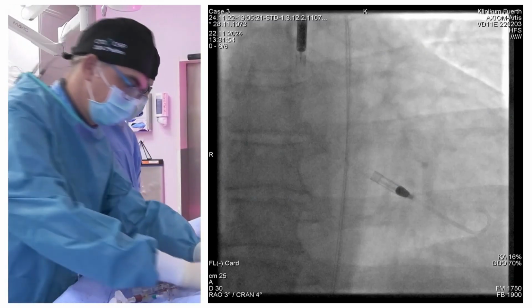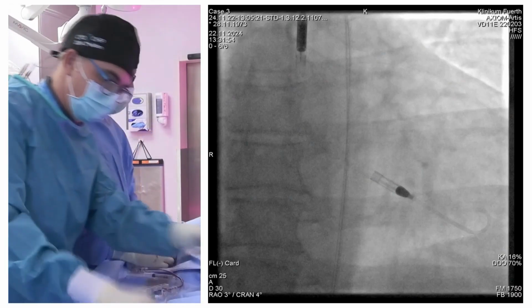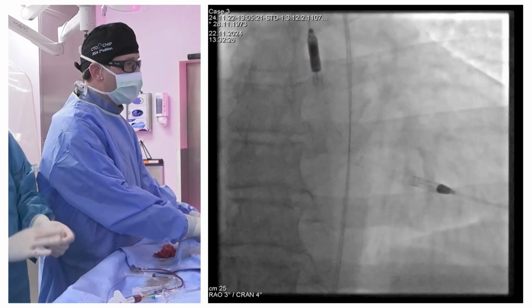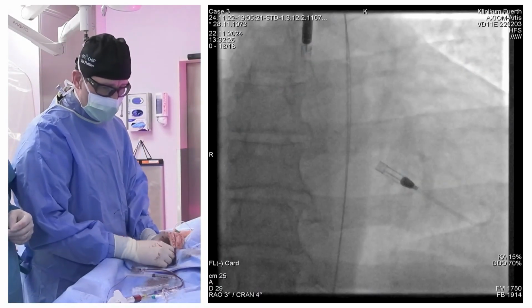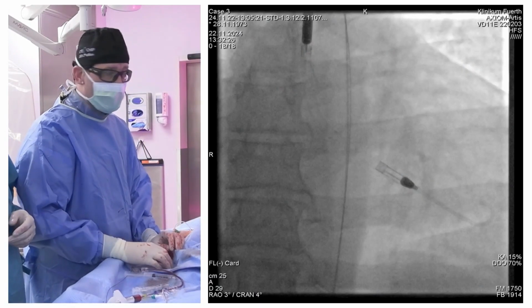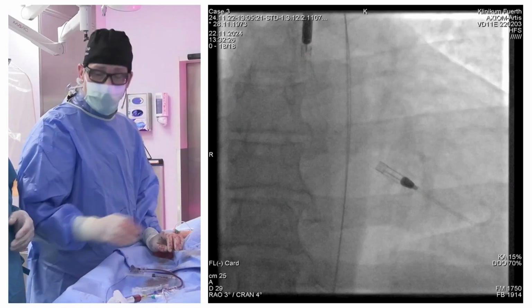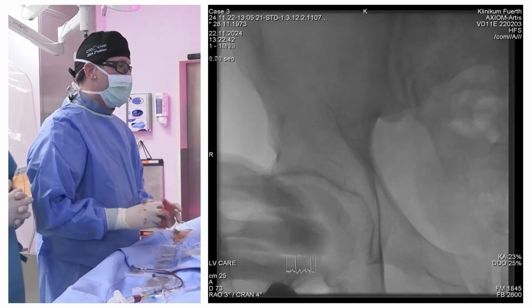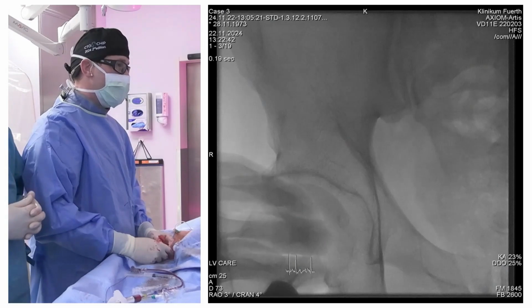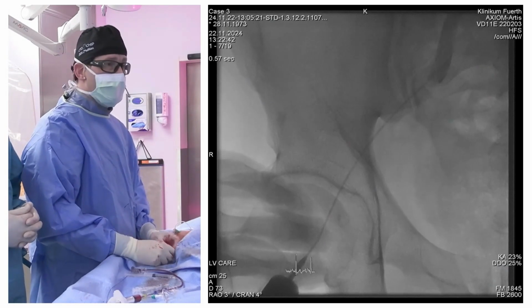Second, the patient is fairly young, and I don't want to put him through several procedural risks. On top, we did a micropuncture with a micropuncture set. We did a nice angio. I don't know if you can appreciate the angio already through the micropuncture set. So it's basically a clean vessel. So if it's possible, why not?